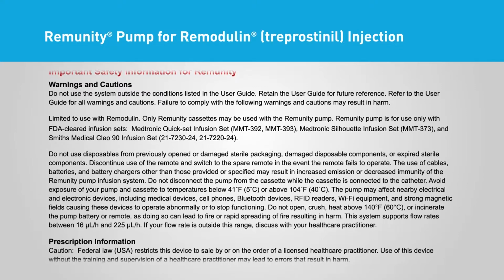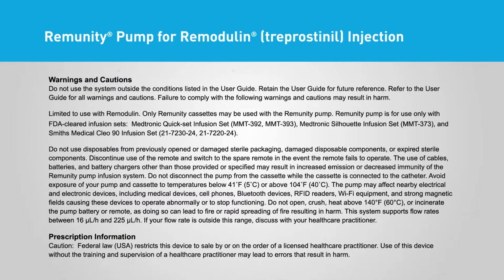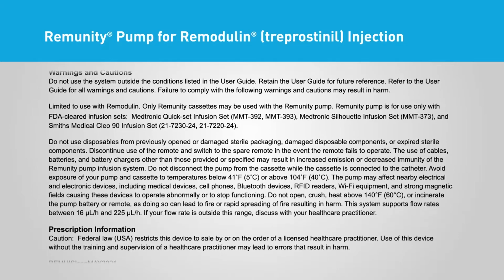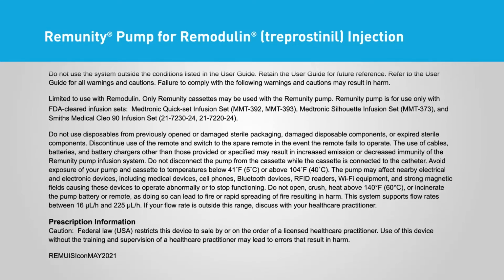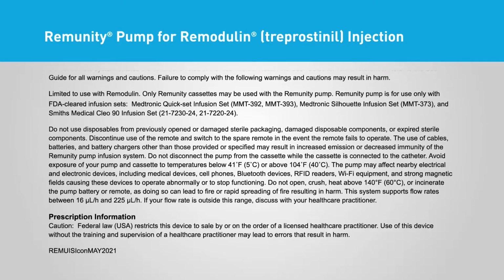The use of cables, batteries, and battery chargers other than those provided or specified may result in increased emission or decreased immunity of the Remunity Pump infusion system. Do not disconnect the pump from the cassette while the cassette is connected to the catheter. Avoid exposure of your pump and cassette to temperatures below 41 degrees Fahrenheit, 5 degrees Celsius, or above 104 degrees Fahrenheit, 40 degrees Celsius.